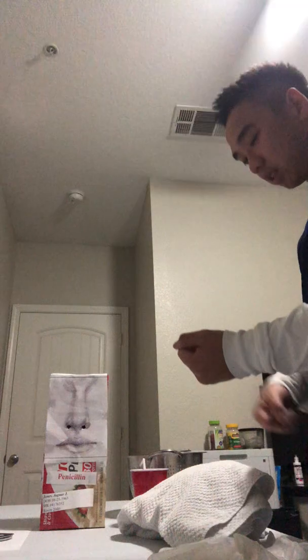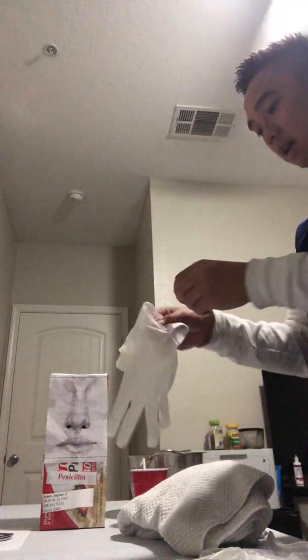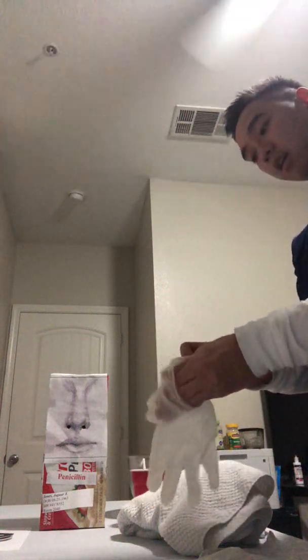Normally I don't have my piston tip syringe here with me. Normally I would loosen the plunger. Don't have it today, so I'm just going to verbalize. After that, I'm going to apply clean gloves.